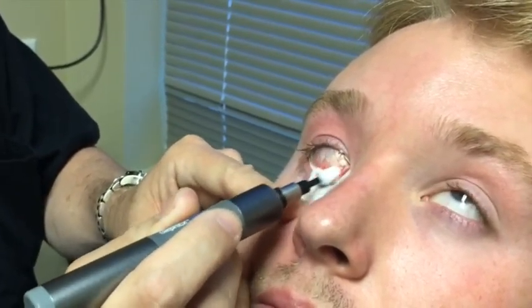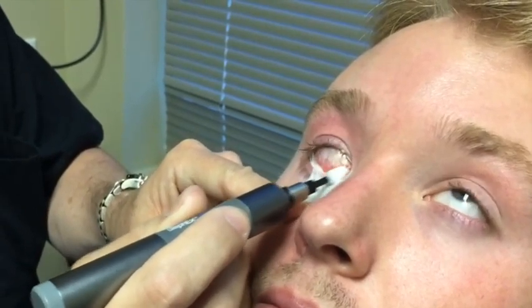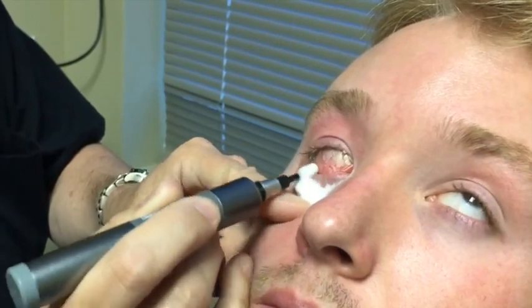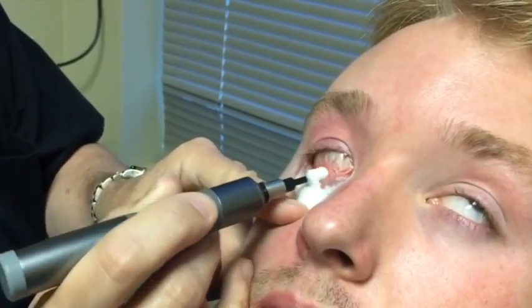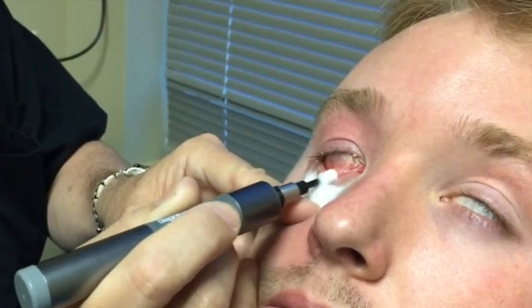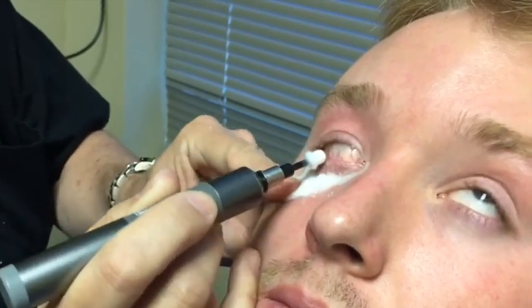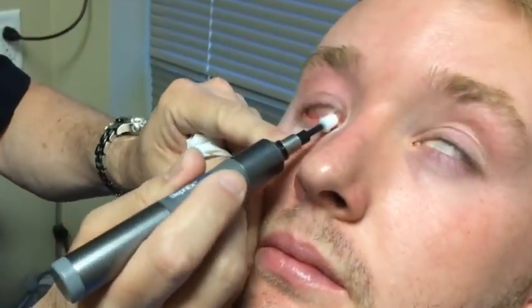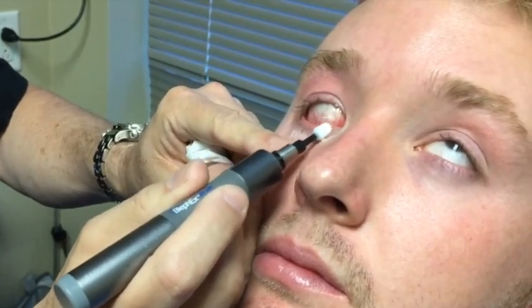Now spinning the other direction, you can't tell in the video, but the little sponge is spinning in the opposite direction, and we do the same thing again. I'm treating the entire lid margin, lashes, and especially over those meibomian glands. That's what gets that lid margin totally, completely clean. If you get wet, we'll just simply take a tissue and come in and dry that lid, dry your fingers so you can maintain good traction to get that lid down.